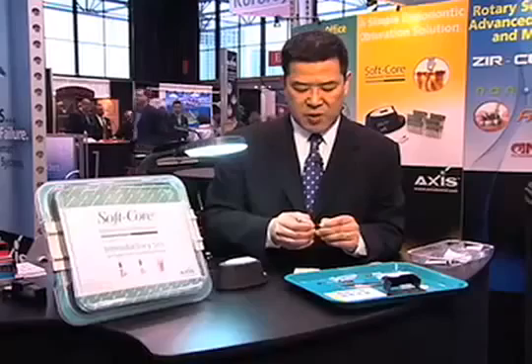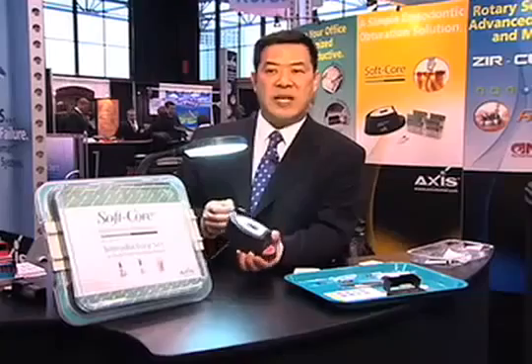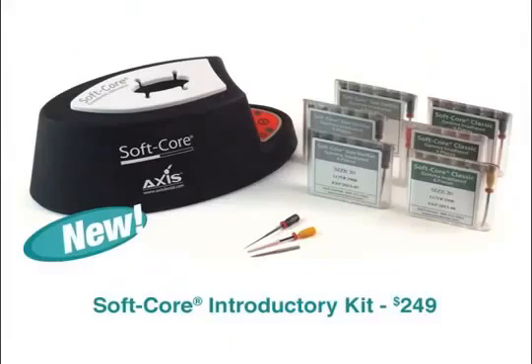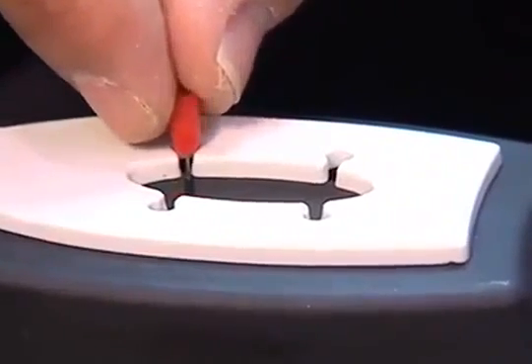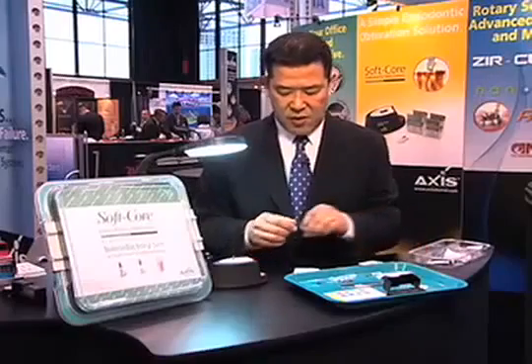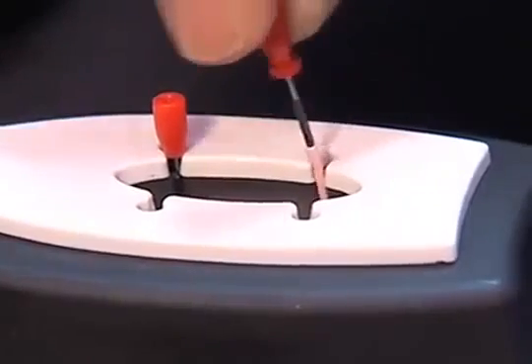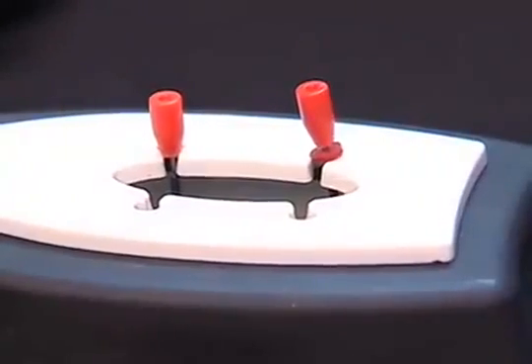So I'm going to place this pin in so it's easy to remove, and I'm going to come over here to the heater. The new heater that Axis has is a nice small compact unit. It has a ceramic heating element at the bottom. It's wide open, so it's really easy to place the obturator into the heater. Here I am, I'm going to put it into the heater and suspend it by the handle. It's probably better to suspend it by the handle than by the rubber stop, because you could change your working length just like it went there. You can actually alter your working length if you let the weight of it sit on the stop.